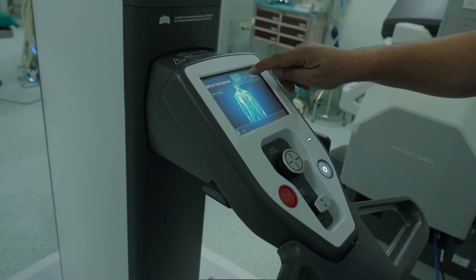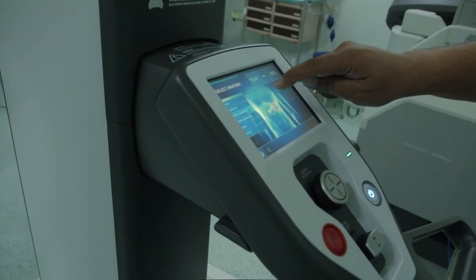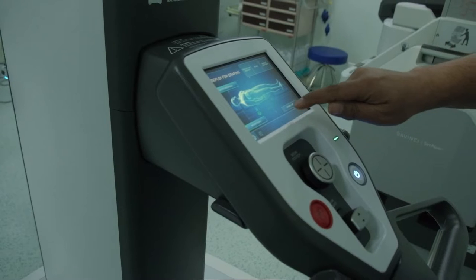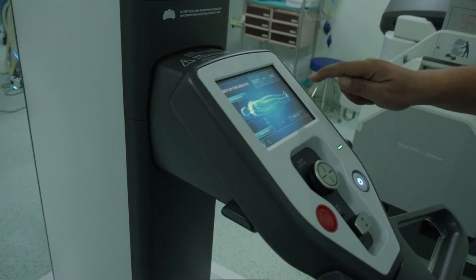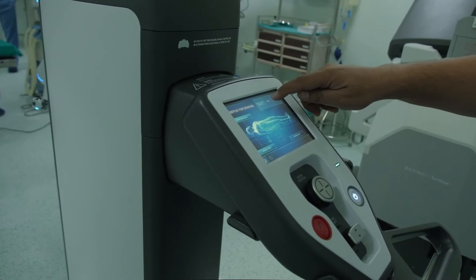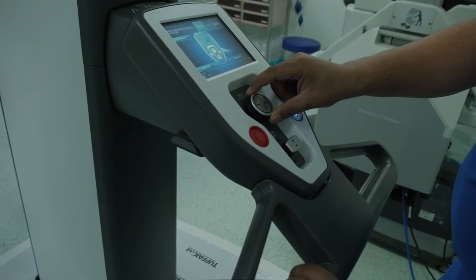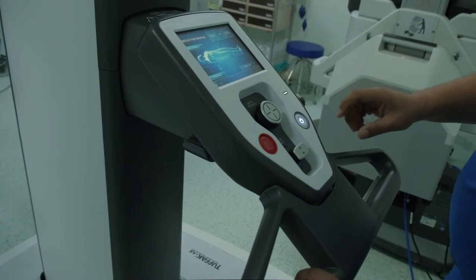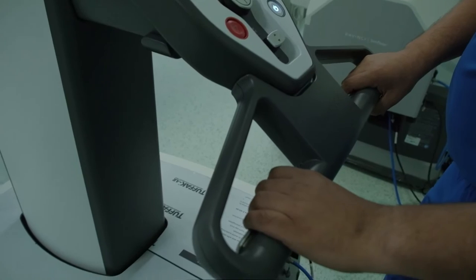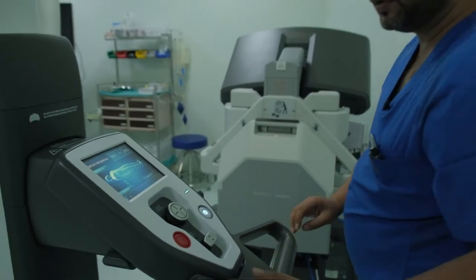So we drape and then we select the anatomy. If we select the upper abdominal anatomy, we select whether the patient cart is coming from the patient's right, and then we deploy for draping. Once the patient cart is deployed for draping, we can also change the boom position after we drape the patient cart. These handles allow us to put this patient cart into the right position, whatever is required.